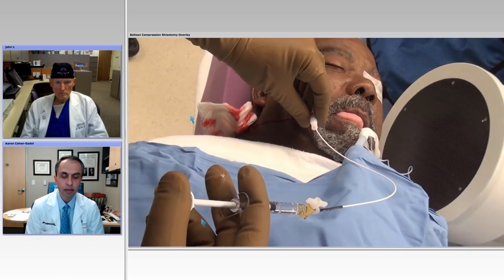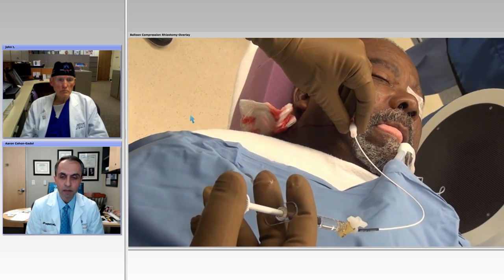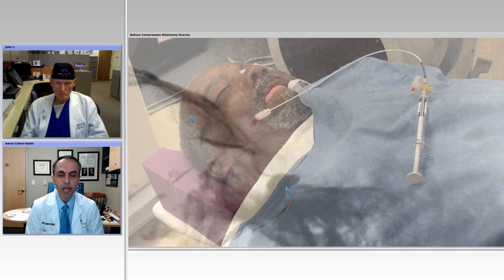We go ahead and advance the catheter and inflate the balloon under live fluoroscopy or getting multiple images consecutively. And you can see the balloon gets inflated, and you can also appreciate a little indentation, or you could say elevation, that tells you that's V2. So we're right where we would like to be. We're in the Gasserian cistern. You can see sometimes the balloon can go over the petrous ridge if it's inflated too much. But here is really V2 as it enters the foramen, and obviously we're in V3. So that's a nice placement of the balloon.